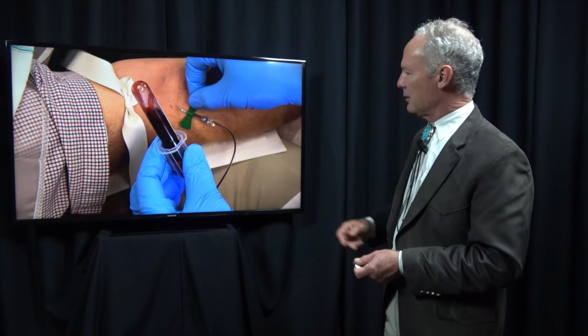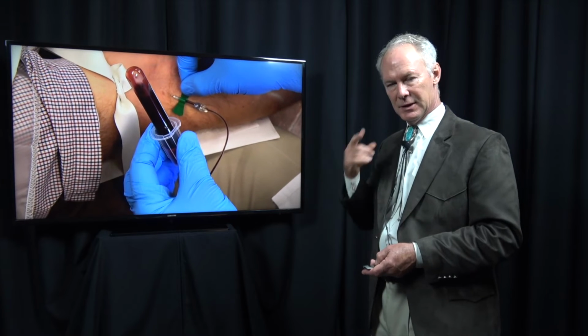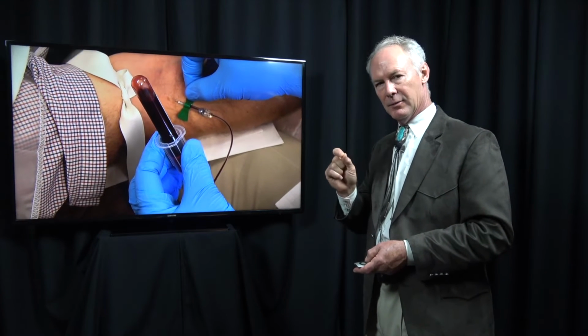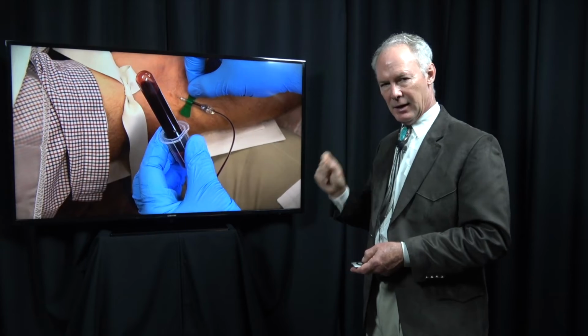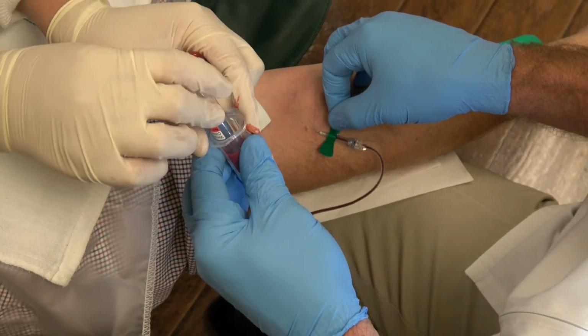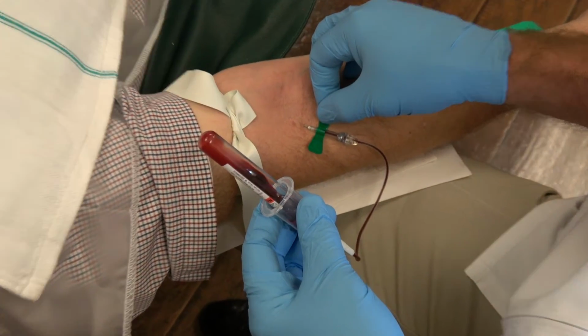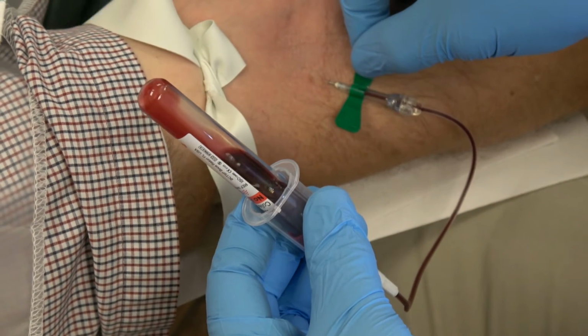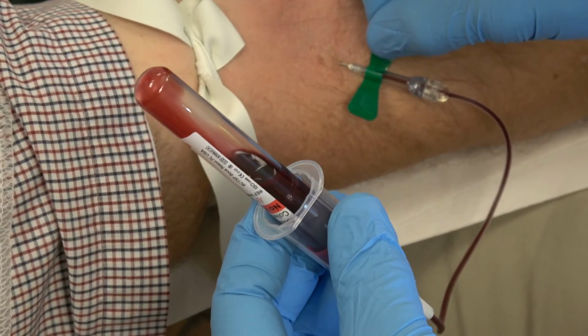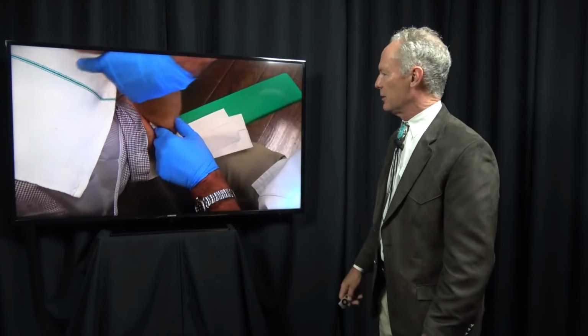So once we draw this blood, we're going to put it in a specific centrifuge and spin it down to form the platelet-rich fibrin clot. You leave the tourniquet in place while you draw the blood, and be conscious of how long the tourniquet has been on the arm. You really don't want to leave it on there more than a couple of minutes. Apply pressure for, if it's a vein, a couple of minutes. And you're drawing the blood, of course, from the vein, not from an artery.